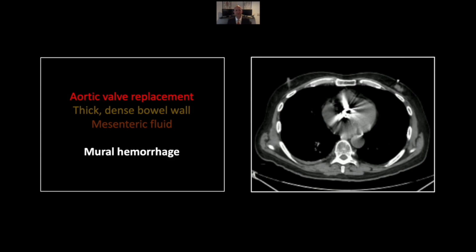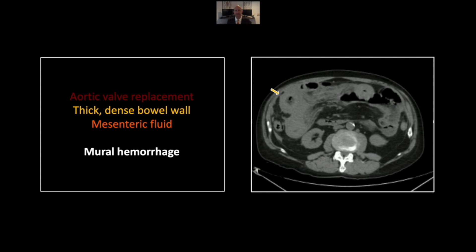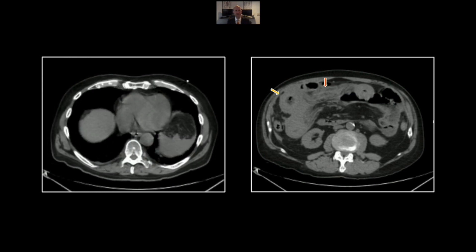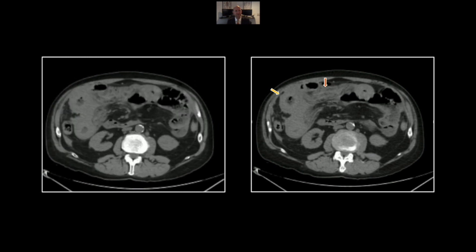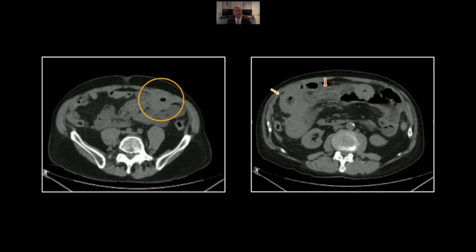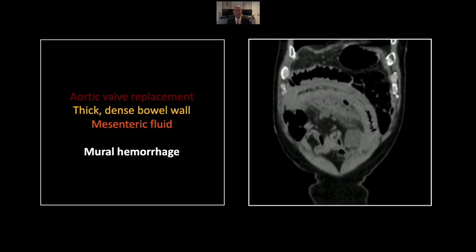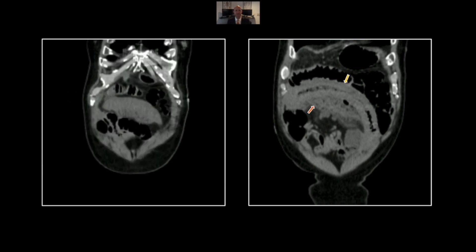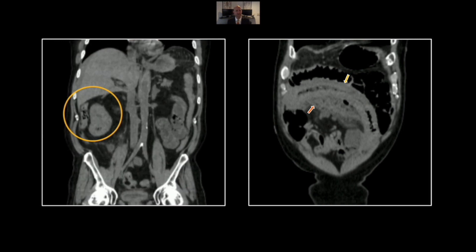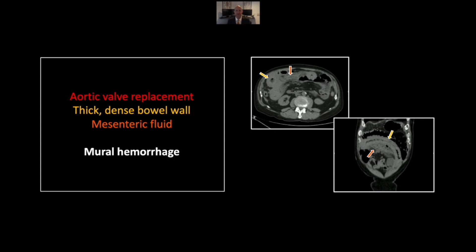Our next case is mural hemorrhage of the small bowel. I like to point out these valve replacements — this patient is at risk for embolic phenomena, but also hemorrhage given the high level of anticoagulation many of them require. There is extensive hyperdense small bowel thickening and extensive mesenteric stranding and fluid as well. There again is that aortic valve replacement. Now the extensive small bowel wall thickening is present throughout a very long stretch of bowel, and on the coronal view the extent can really be appreciated, with bowel wall thickening and mesenteric stranding. That is a case of mural hemorrhage of the small bowel.